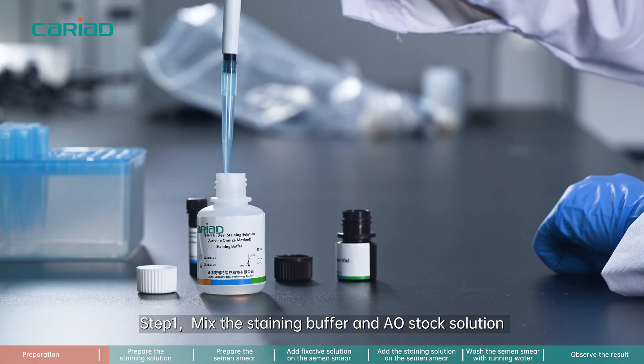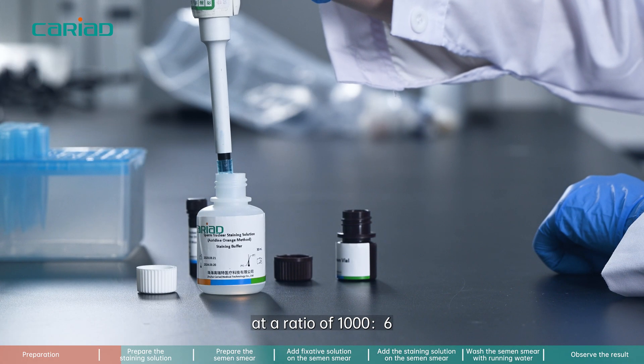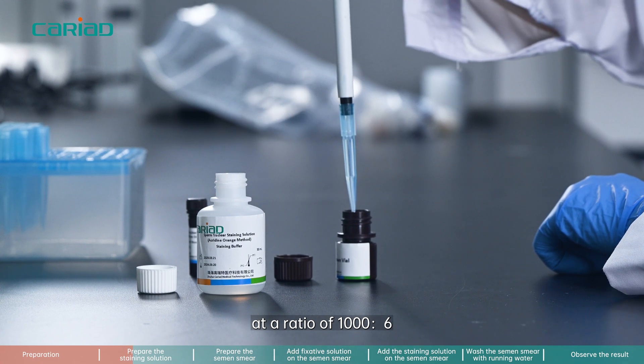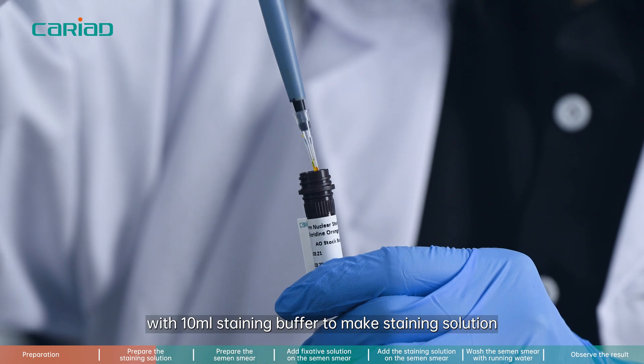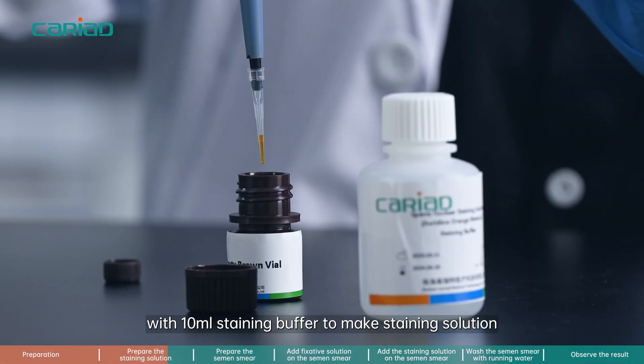Step 1. Mix the staining buffer and AO stock solution at a ratio of 1000 to 6. For example, dilute 60 microliter AO stock solution with 10 milliliter staining buffer to make staining solution.